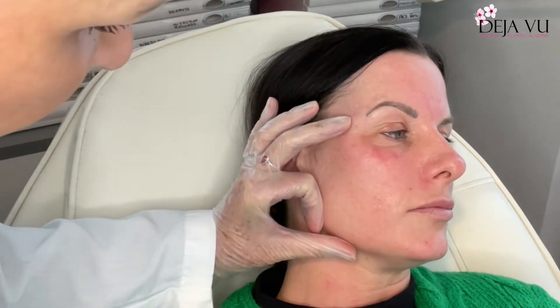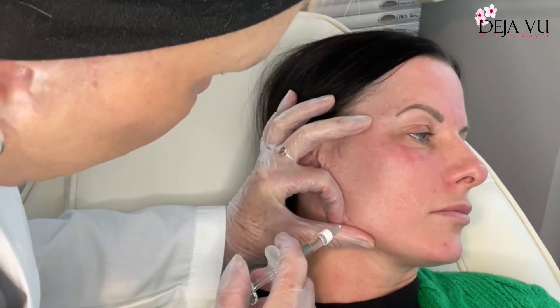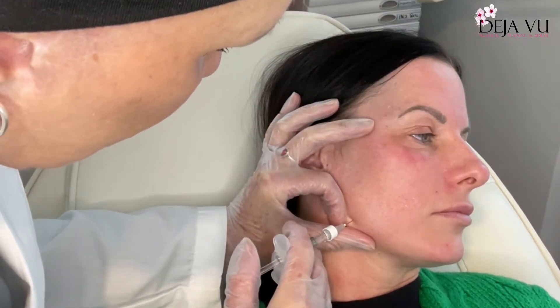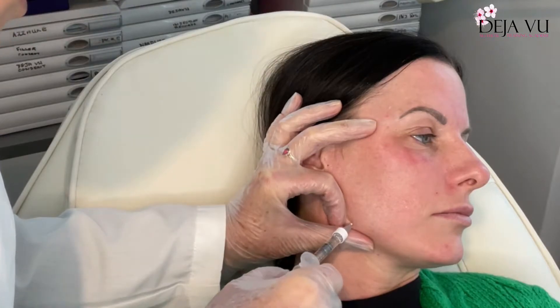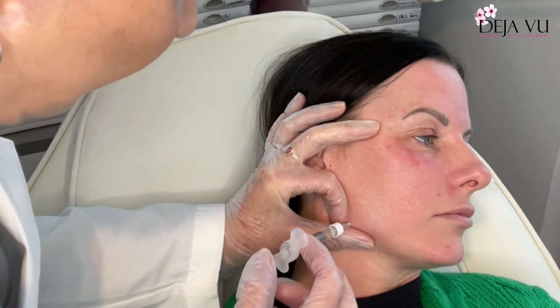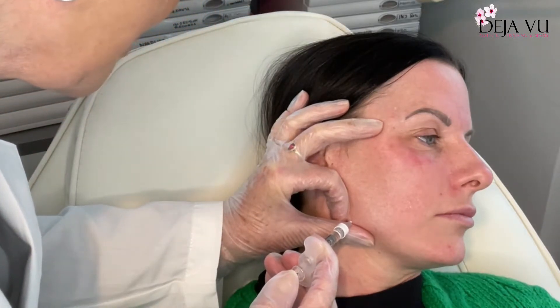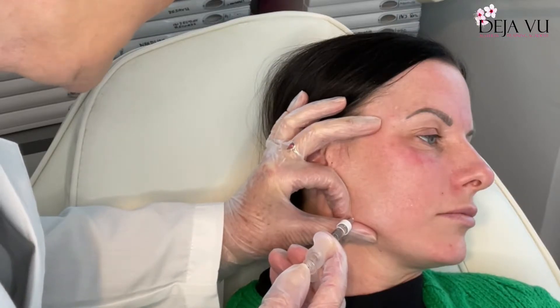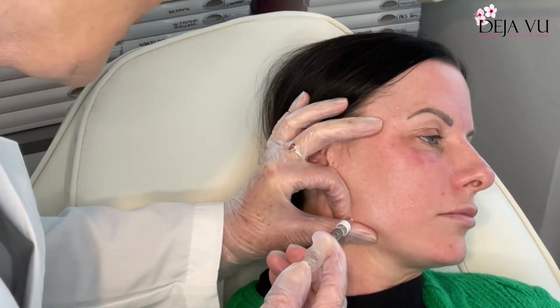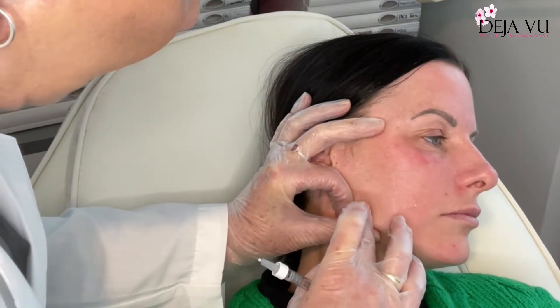I'm going to use M4 Plus, putting my fingers in a shape like that on the mandible. Let's get this dead right — going down to the mandible, aspirating. I'm going to put about 0.3, 0.2, 0.3, right down to the bone, pressing in as I go. Take it out very slowly, then gently press this down.